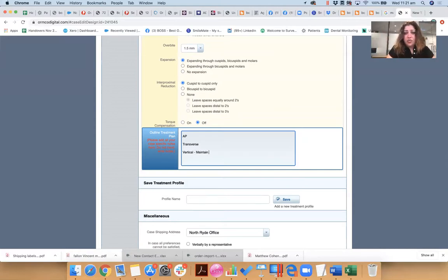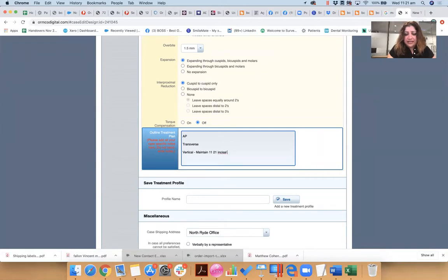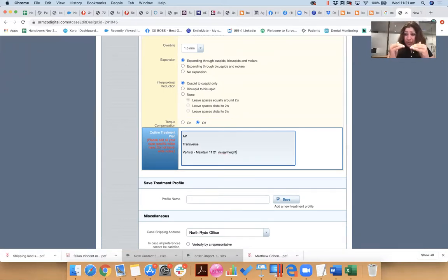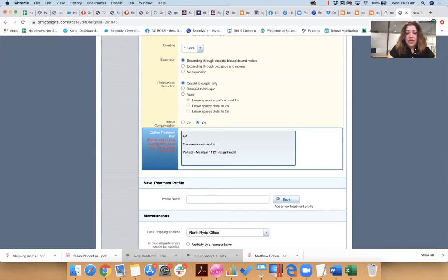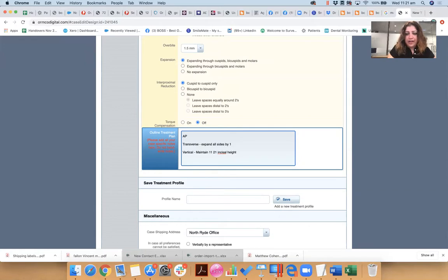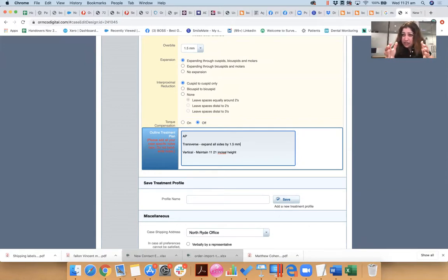So I always start with my central incisors, you know, maintain 1-1, 2-1 incisal height might be something we need to do. Or you might want to intrude it, right? And you give them approximations, how much arch expansion you want. You know, expand all sides by one to two millimeters, for example, or 1.5 millimeters. So we have a bit of arch expansion built in per side.